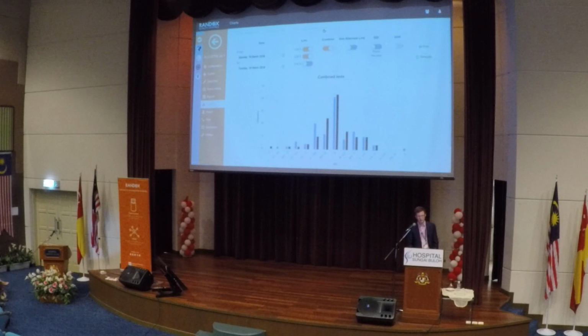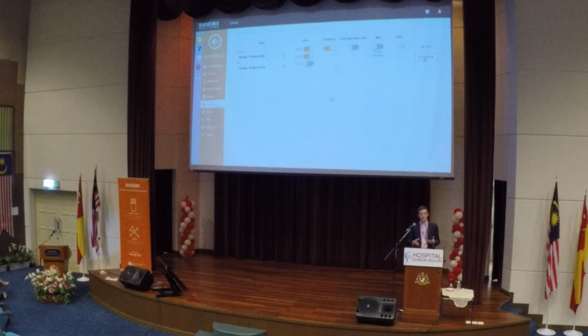The next chart we will look at is our performance summary chart. With our Levey-Jennings and our histogram charts, we're looking specifically at our own lab's data, whereas with the performance summary chart, we are looking at our lab's data compared to peer group data. So again, it answers that question, when do we use the peer group and in what context? This is one of the best ways to use that peer group data for comparison.